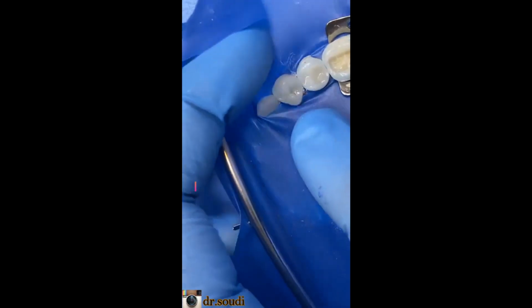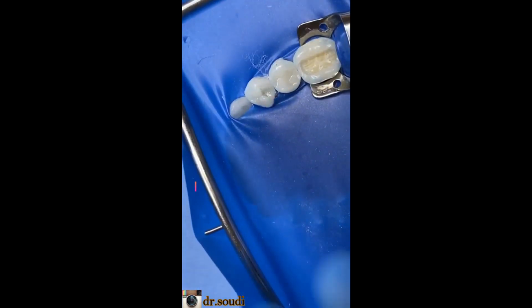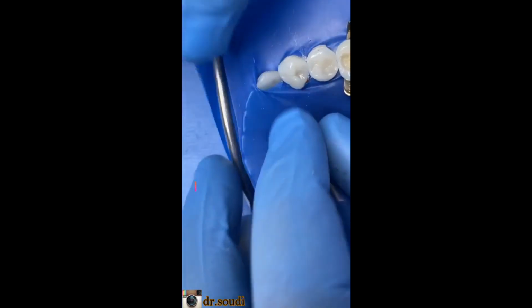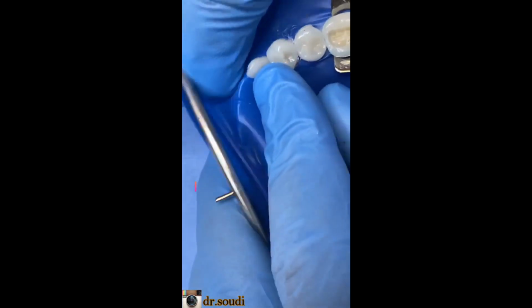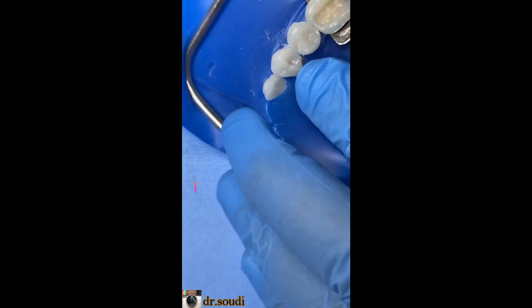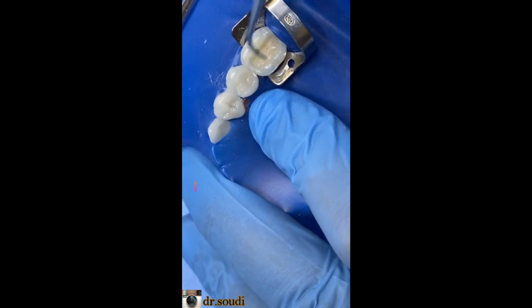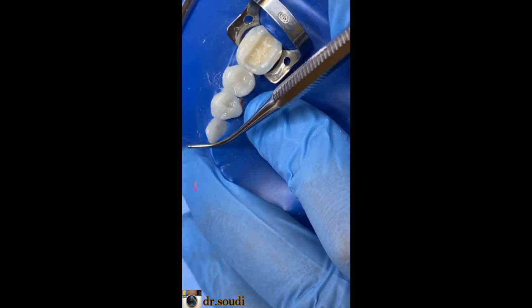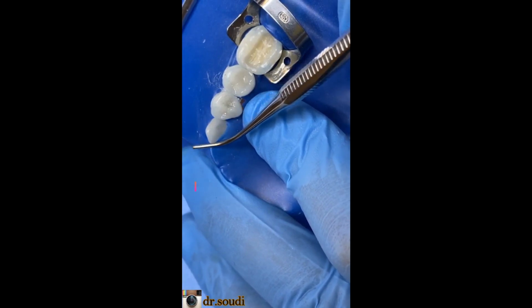Now I think I can fix it now. Okay, it's better now. Okay, so there is one more trick for the anterior part of your isolation here, the anterior part. You have two choices. The anterior part here in the canine. If I'm making a quadrant isolation, I still have to make it stable here.